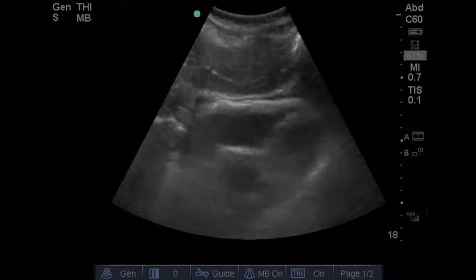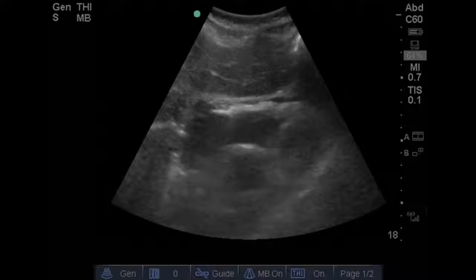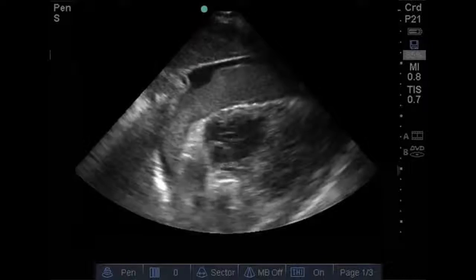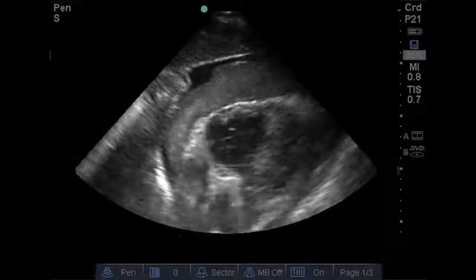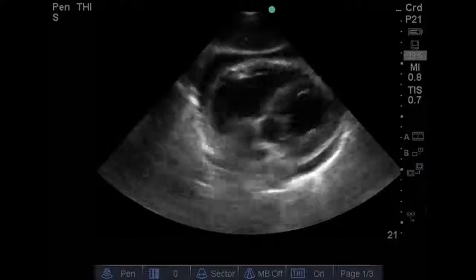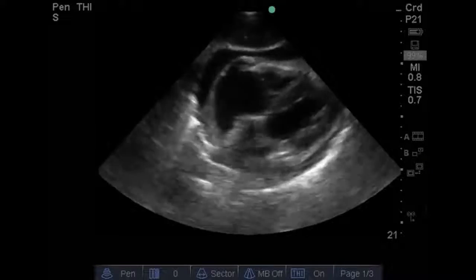And here's a view where we can see a pericardial effusion with the anechoic layer separating the heart and the pericardium, which is abutting the diaphragm as one continuous line. Here we can see another sample where we have pericardial fluid. Here we can see another example where we have pericardial fluid and a pericardial effusion. We also see the presence of pericardial clot within that pericardial space. Here we see pericardial effusion. However, this is concerning because the pericardial effusion is actually impacting cardiac function. We see that the right-sided structures, both the right atrium and the right ventricle, are not contracting normally.